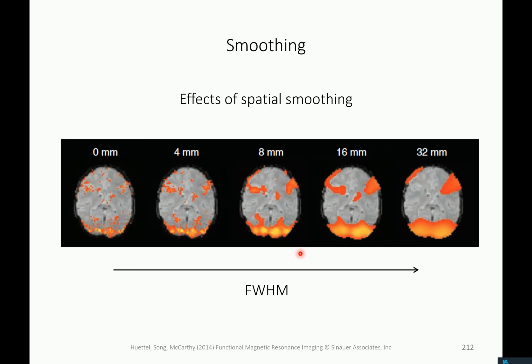This is your data, in 1D here, and then you create a filter that is also of course discrete, and you apply this filter essentially for all data points.